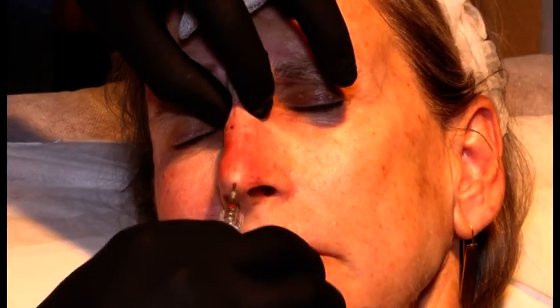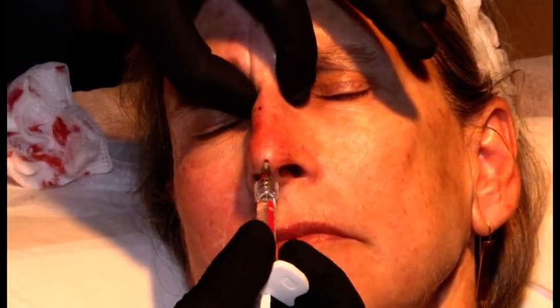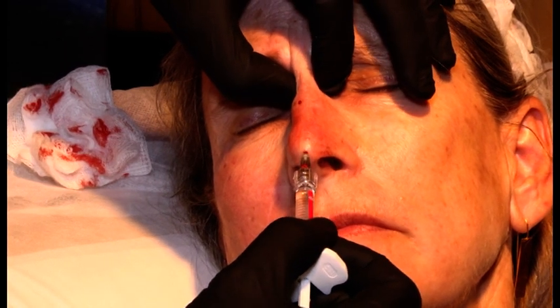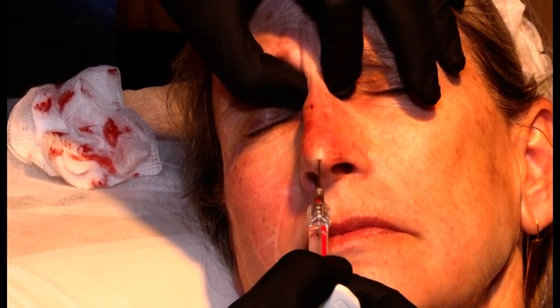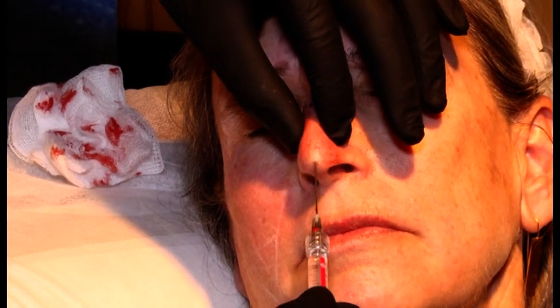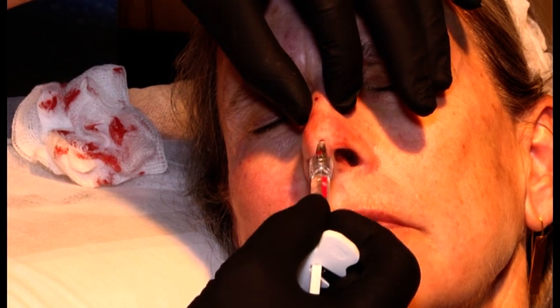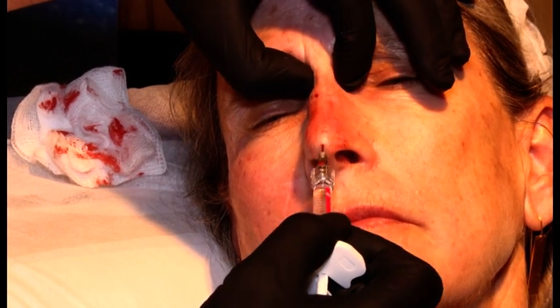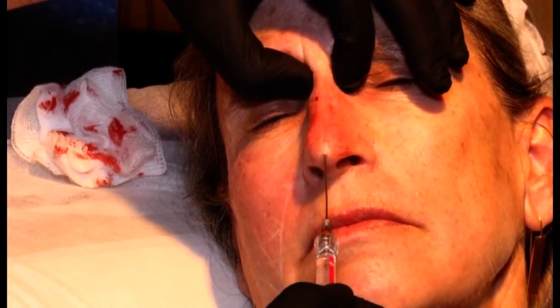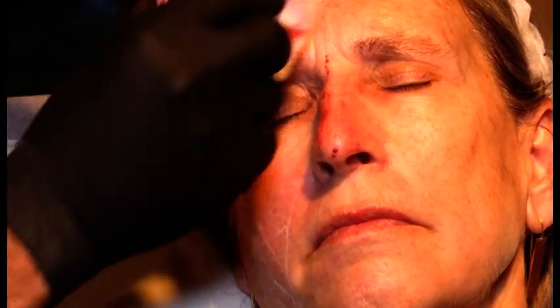I just very gently wiggle until the cannula is up here. This is for light reflection. Again, I press here and a retrograde linear thread of 0.025. Again, the same amount, 0.025. I re-advance subcutaneously and 0.025. And I think 0.05 is enough to create a little bit more sharpness in light reflection.